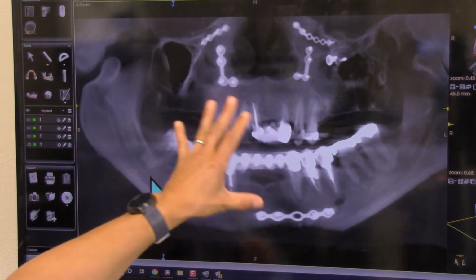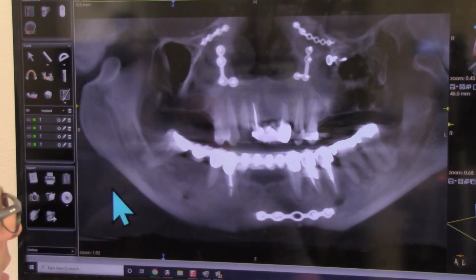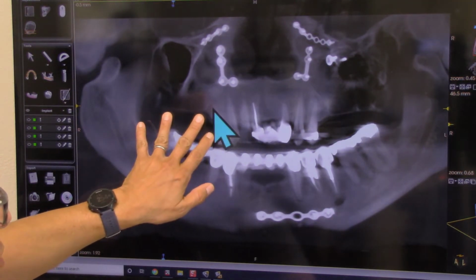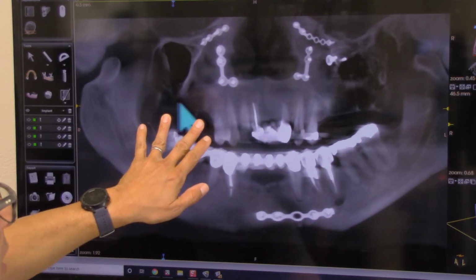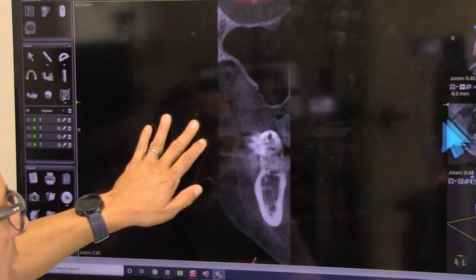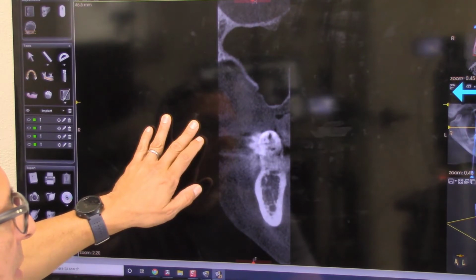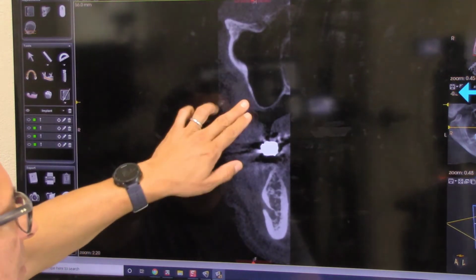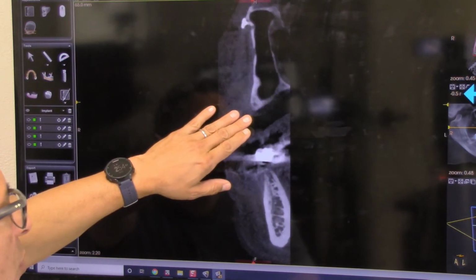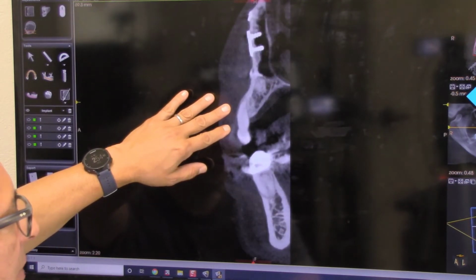So anyway, we don't have that concern here, but our biggest concerns are really the bone up here in these areas here. So there's just really no bone up in the sinus or below the sinus floor. We can look at the sinus floor here. It's super paper thin. And as we go along, let's go a little bit more towards the teeth. And it remains very, very thin here, coming through until we get to where the teeth start. And then here's where our teeth are. So we have a very, very thin amount of bone.